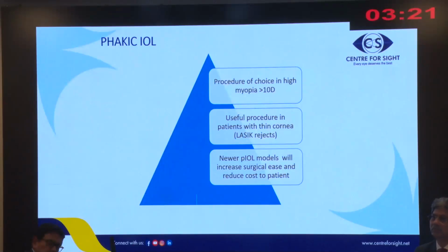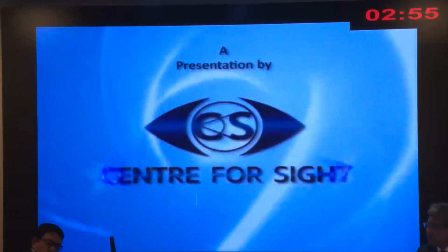It's giving excellent outcomes. Sorry, I need to change the slide, but it is the procedure of choice, and I have now brought it down to 8 diopters. It is also used in irregular corneas, LASIK rejects, etc., and new models are increasing, and whether the phakic presbyopic implants are going to work or not, that's the ultimate answer. So I think you can all adapt this particular technology if you are doing cataract surgery. Thank you very much for your kind attention.